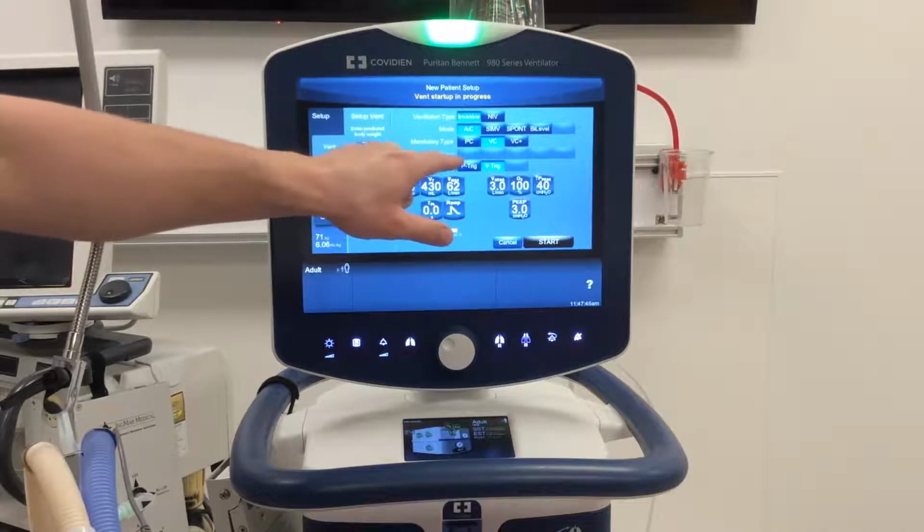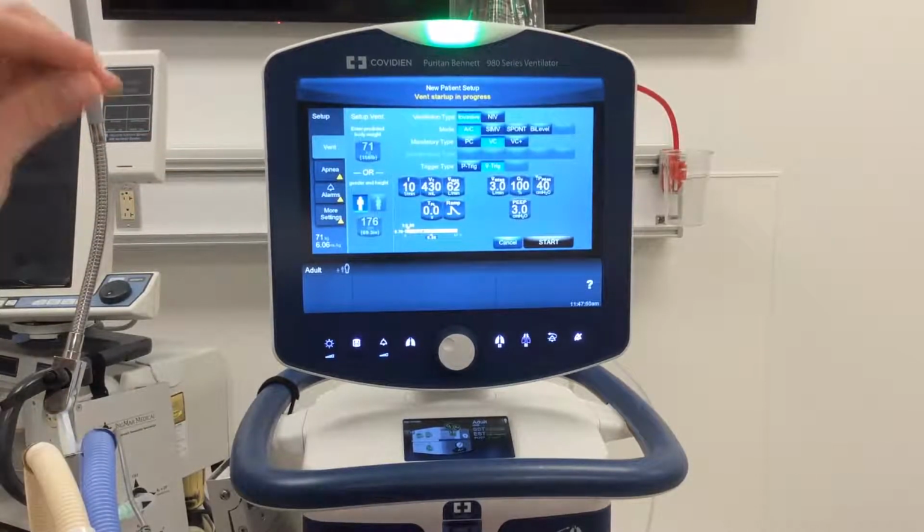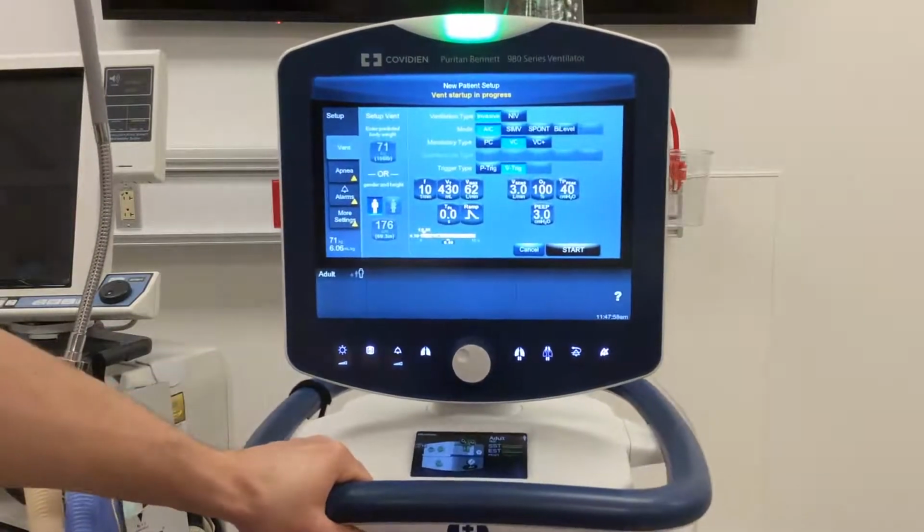You can see spontaneous type is grayed out here. And the reason being, the ventilator is not going to allow you to set something that is non-applicable in this current mode of ventilation. Okay, so when you think about what we're doing, I'm going to bring this ventilator a little bit closer here so you can maybe see a little better.